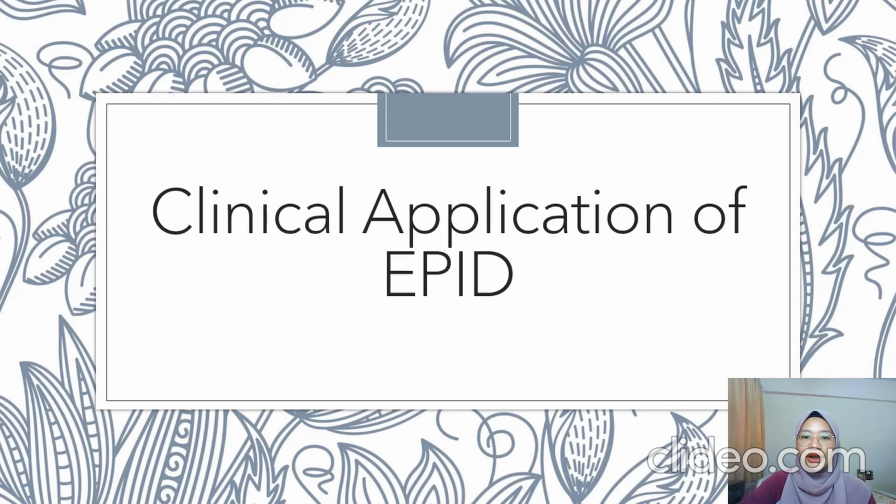Hi, I am Nurul Afina and I will be presenting on the clinical application of the EPID. With the introduction of IMRT, the use of EPID for dosimetry has received more attention. So the question is, what is the use of the EPID in the clinical routine?